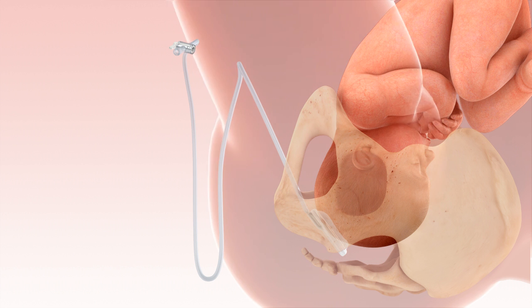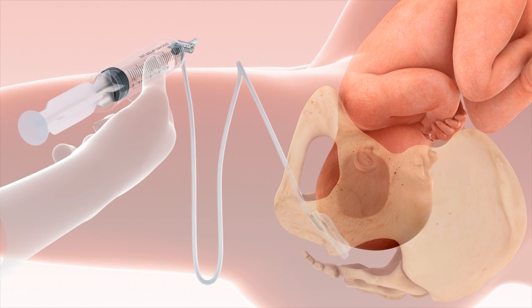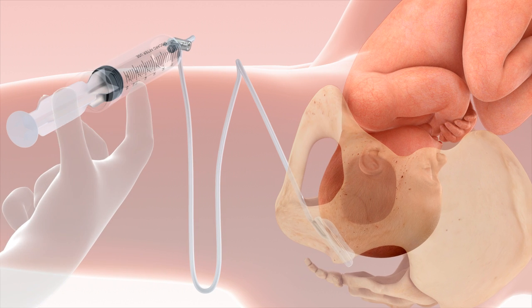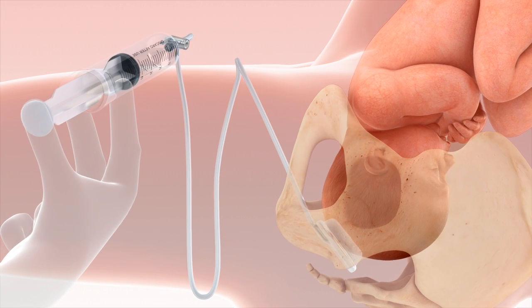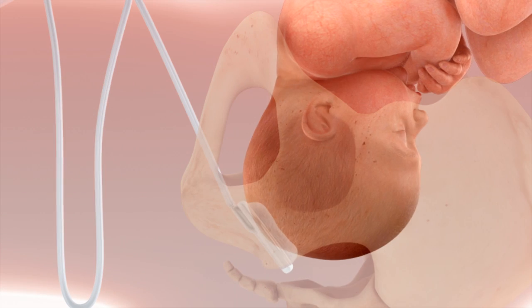The device is now ready to be inflated. Use the 60ml syringe provided to inflate using sterile saline. A total of 180ml of saline should be used for inflation. This allows easier and less traumatic delivery of the baby and reduces complications.